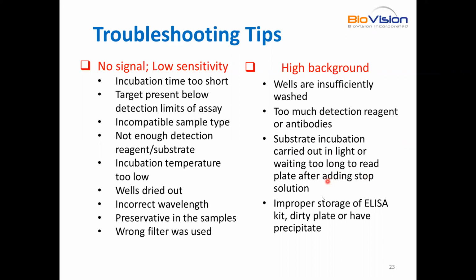It could be that they are getting high background because they have not stored their ELISA kits properly, and the kit is already exposed or dried out, or the plate is dirty or has some precipitate in it.